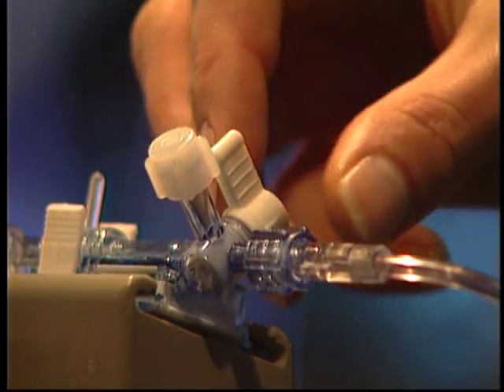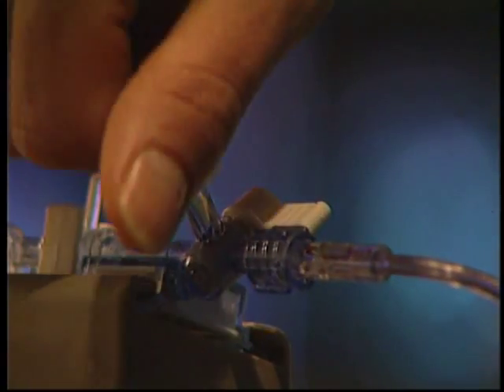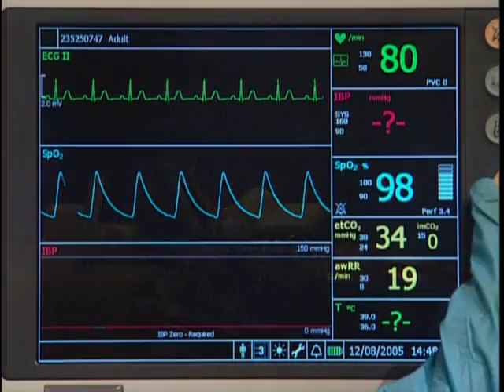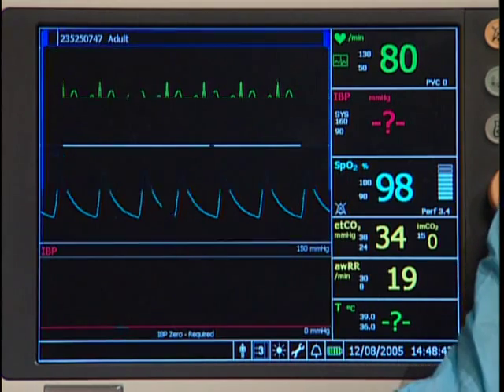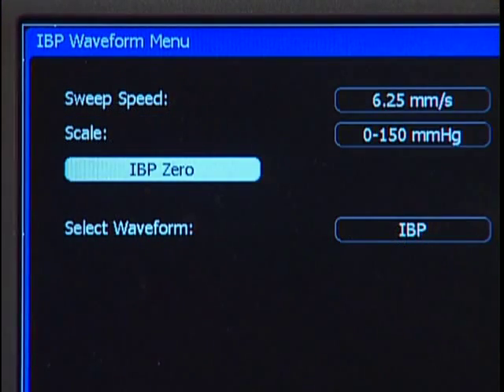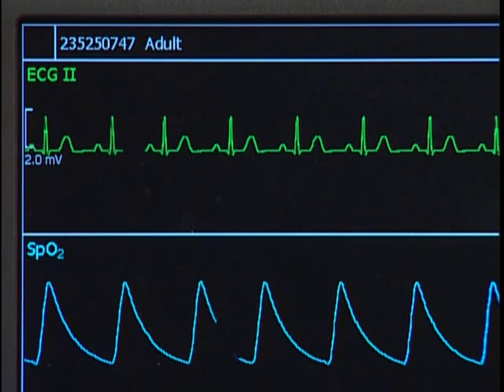To zero the transducer, turn off the stopcock to the patient and open the transducer to atmosphere. Open the IBP waveform menu and click on the IBP zero button to begin the zeroing process.